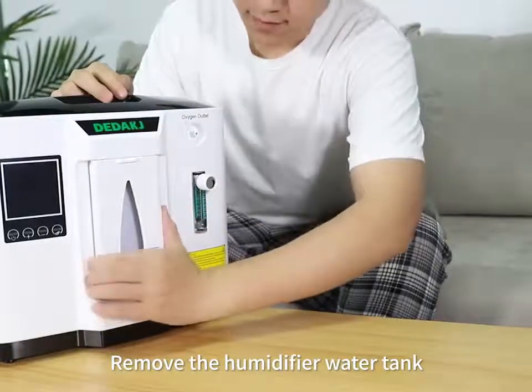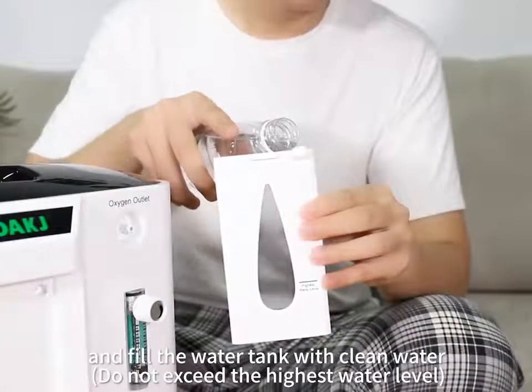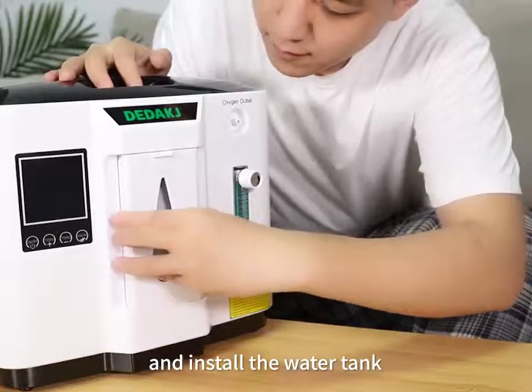Remove the humidifier water tank, open the rubber stopper and fill the water tank with clean water. Plug the rubber stopper and install the water tank.